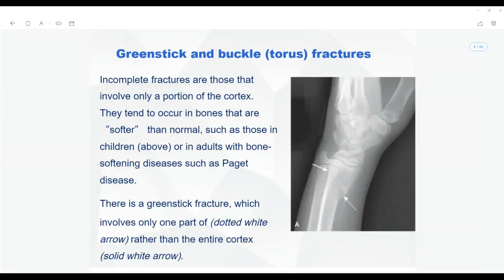See, this is only for practice for now, but we will talk about more things. First, let us try to understand how we are going to define a fracture, to recognize a fracture. That's what we are going to practice here.